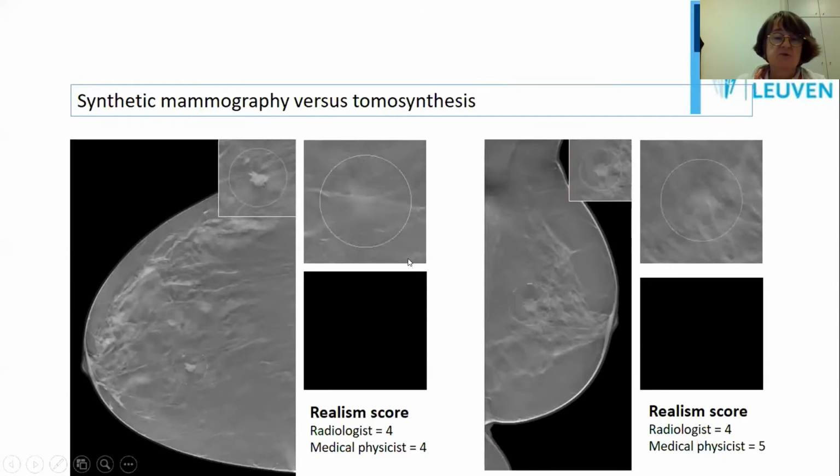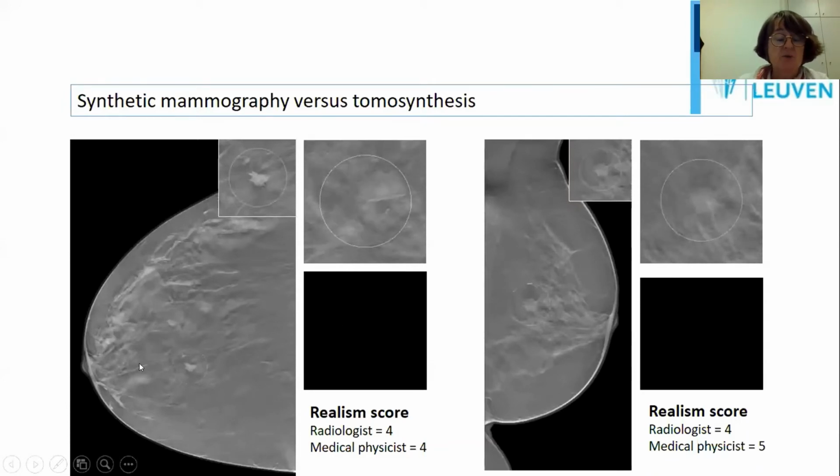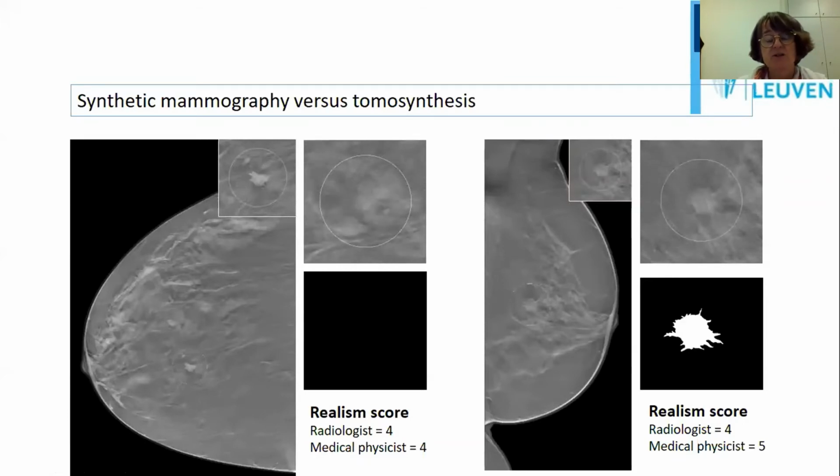So tons of, no, not tons. This study basically used only 8 patient data, I think, if I remember correctly. But from, of course, one patient, you can define several regions of interest. So with a limited number of patients and a nice collection of masses, it's possible to hide masses in this tomo and ask viewers then to detect them.